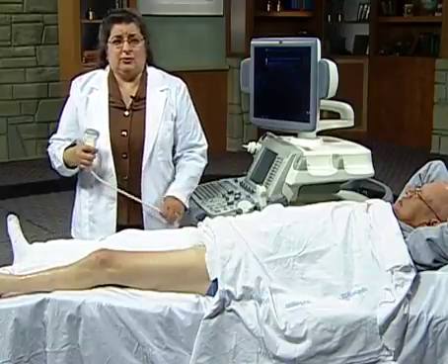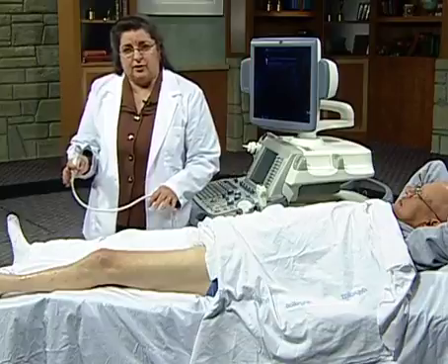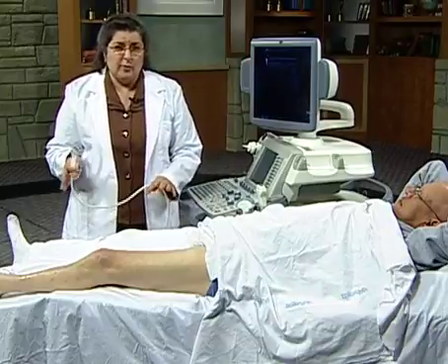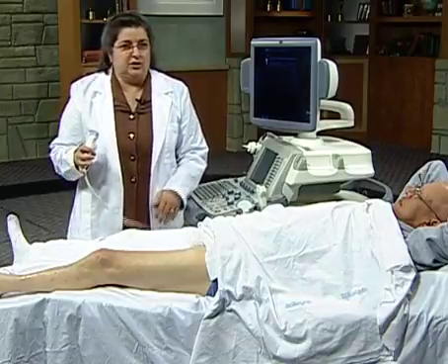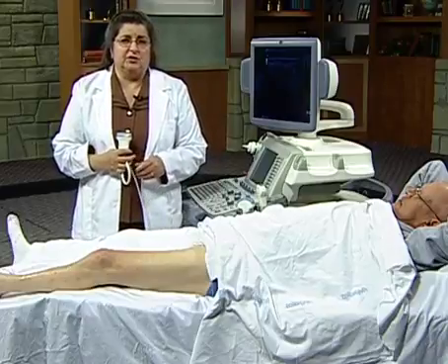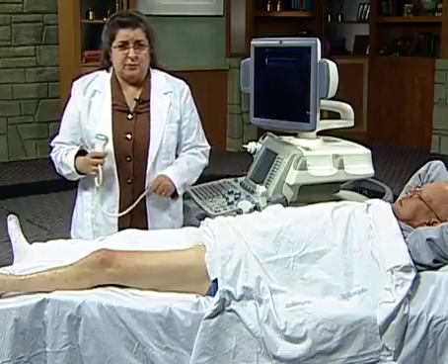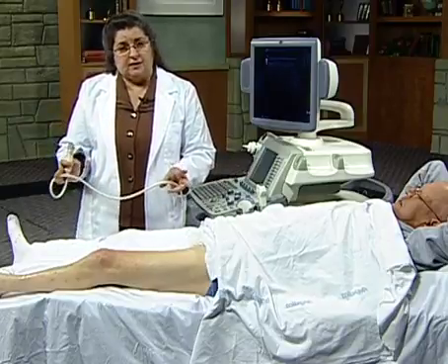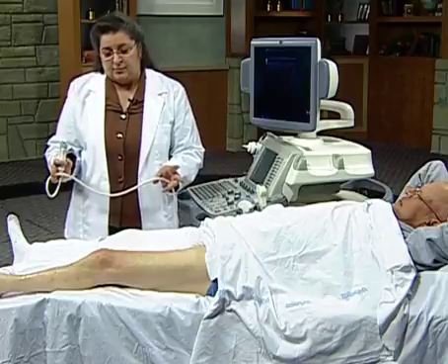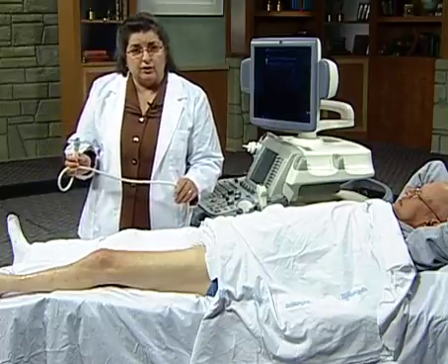Now we're going to take you through a demonstration of an arterial ultrasound on a lower extremity arterial bypass graft. Before we begin the ultrasound, we should talk to our patient and find out what type of bypass they had and get as much information as possible. I know from discussing things with this patient earlier that this is a vein bypass graft that was actually placed in the reverse vein position. And this is about 4 years old.